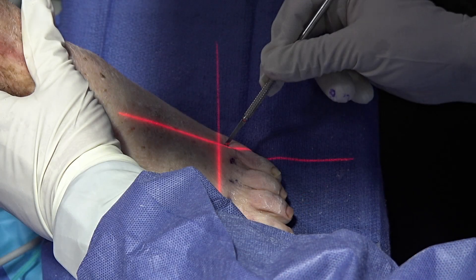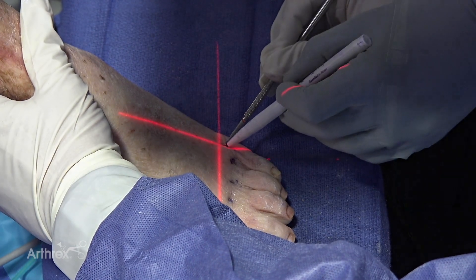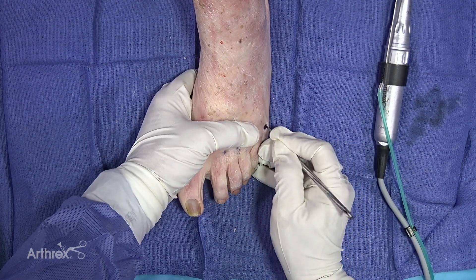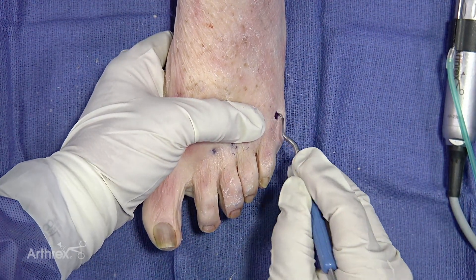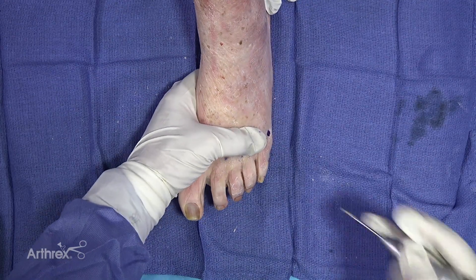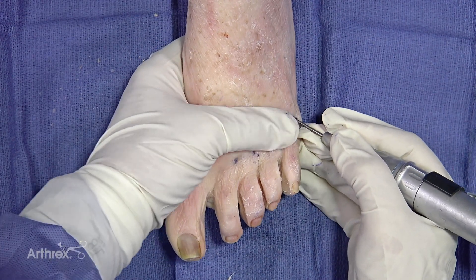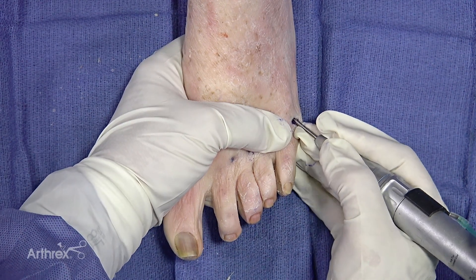We could mark this under fluoro — make sure, because the fifth is a little bit more proximal. You could come right at the metaphyseal flare. In a similar fashion, you're going to make your incision just lateral to the extensor. Use your elevator once again. If I was doing a bunionette, I would definitely make my cut a little bit more angled — sort of 45 degrees. In Europe they tend to make just a straight DMMO, but I kind of like more of the abutment of the 45-degree cut.